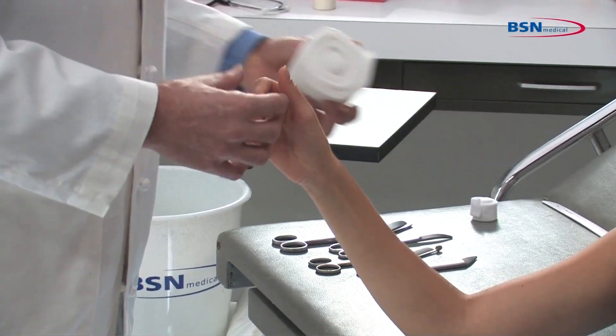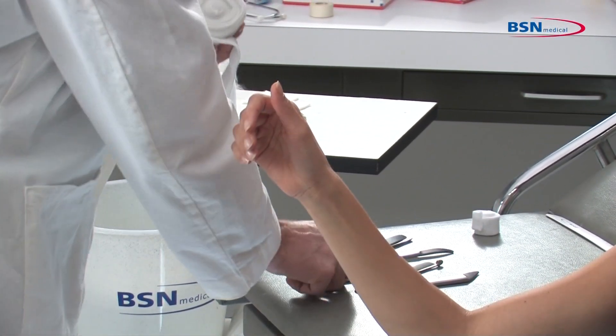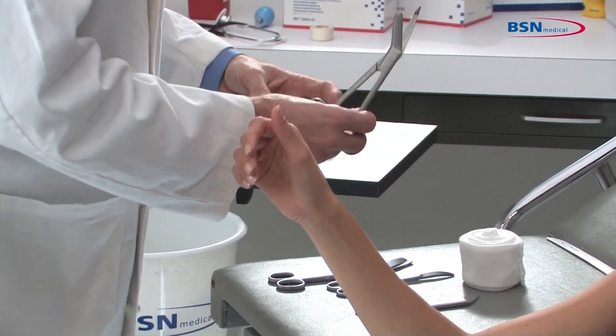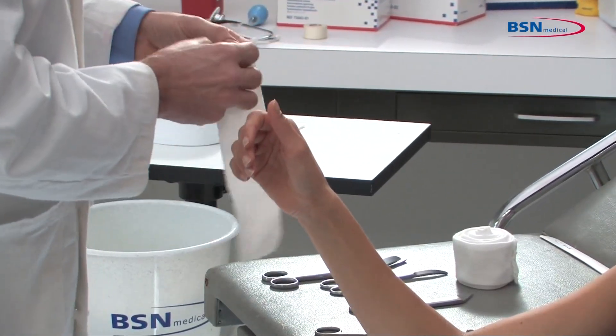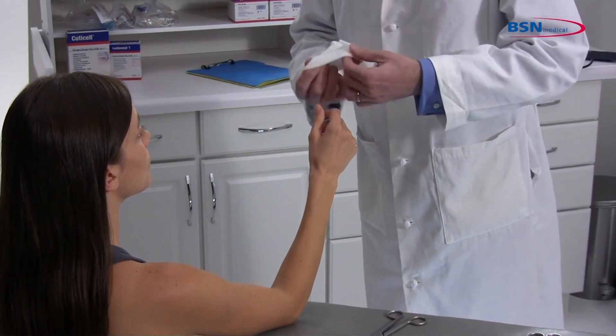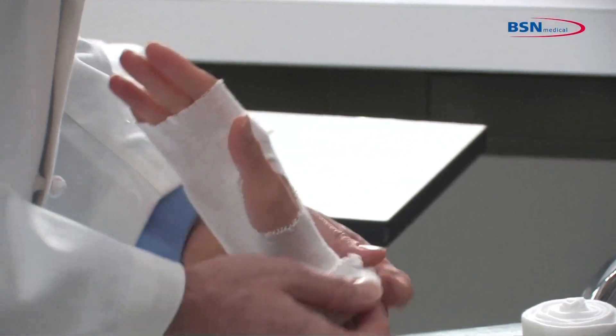Select a stockinette that will not restrict the widest part of the limb. Measure from the distal phalanx to below the wrist joint to protect the skin. Make a small cut with scissors for the thumb hole. Roll up the stockinette before applying on the limb to overcome sliding pressure during application. Roll off and remove all wrinkles and creases.